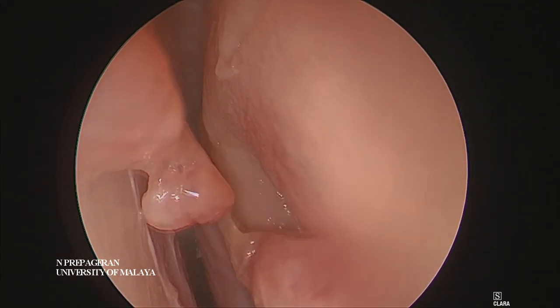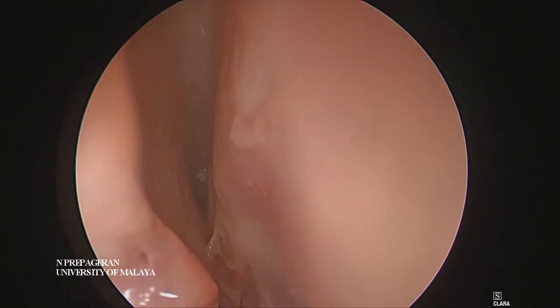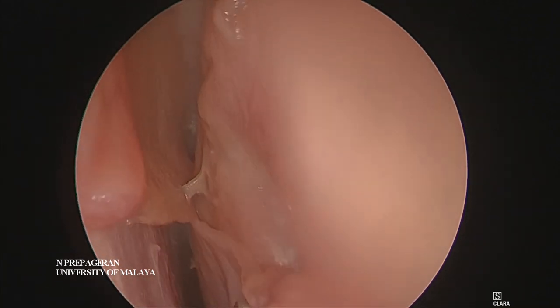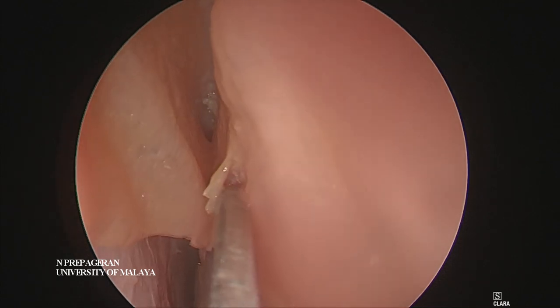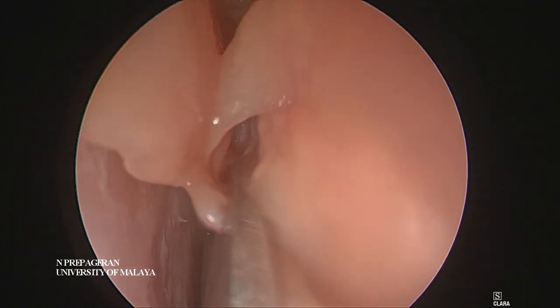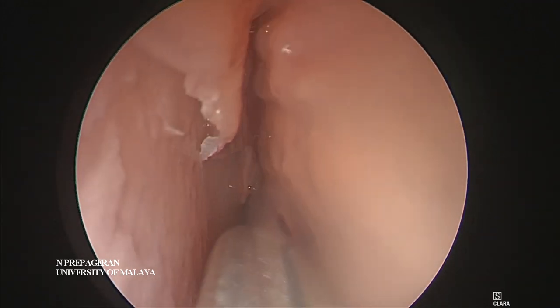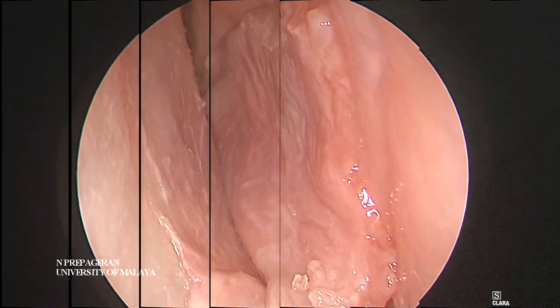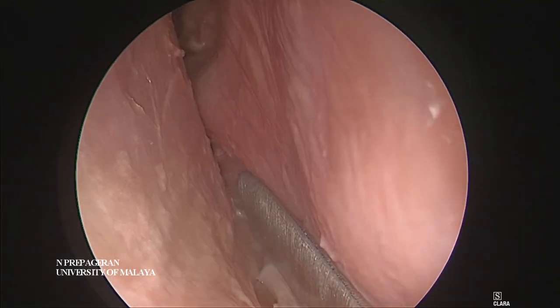Always cut along the middle part of the middle turbinate so that you can preserve the olfactory cleft - you can see it there. I don't go up too high; I always preserve the olfactory cleft. When the scissors are working nicely, you go to just below the opening of the sphenoid sinus. The same way, we elevate the flap from the lower margin.